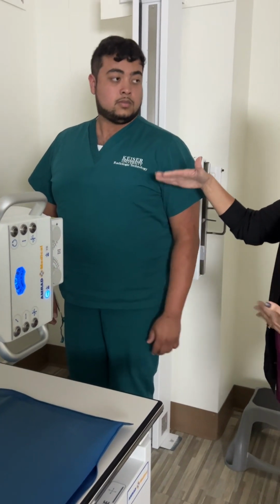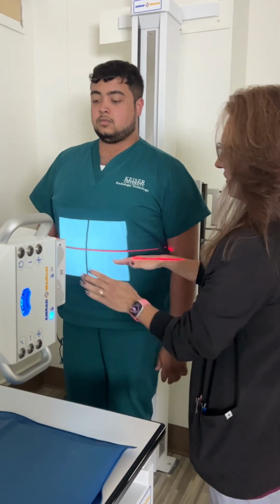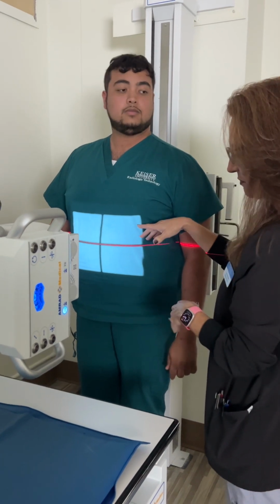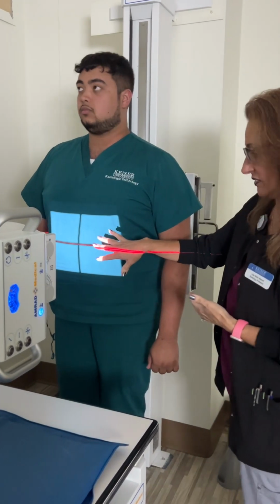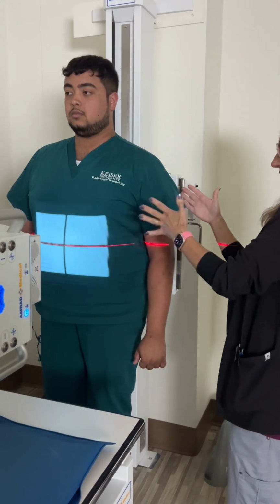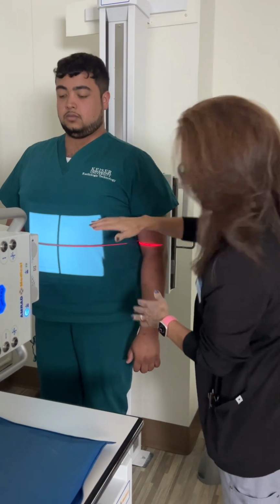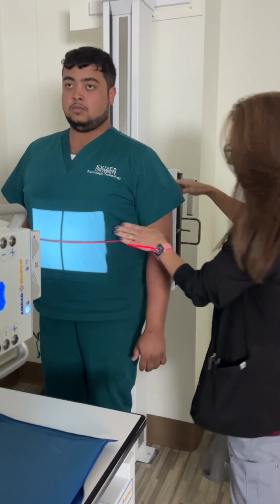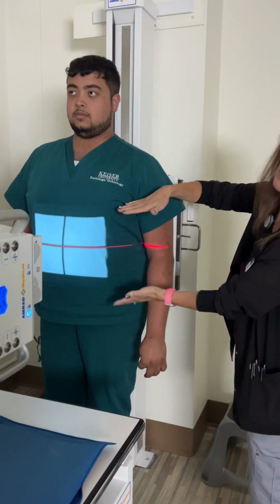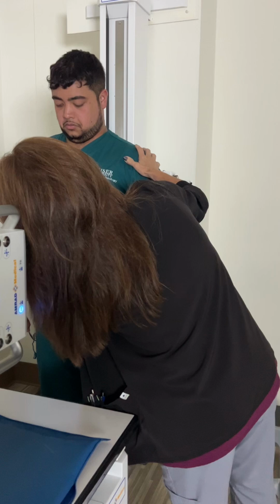And then this is done on exhalation so that when Andrew blows his breath out, the diaphragm will rise. And then ideally it'll be in the top of my light field. Again, the light field is deceptive. Once you put anything in between the light and the board, it automatically looks smaller. So even though it only looks like we're getting to here, my guess would be we're probably getting to about here on Andrew with the divergence of the beam. Okay, so we'll just make sure again he's in the middle.